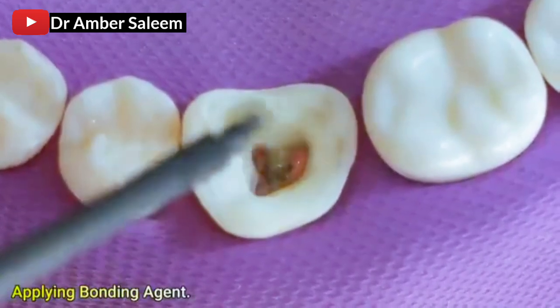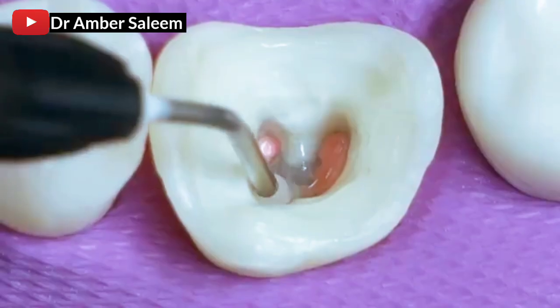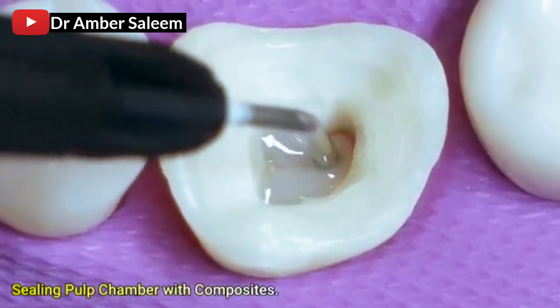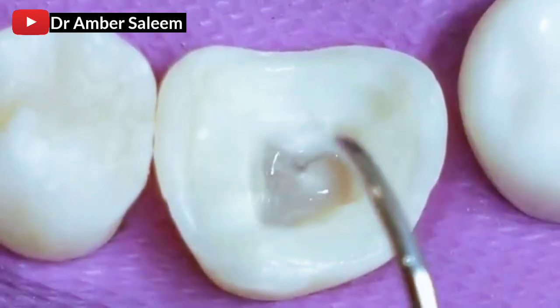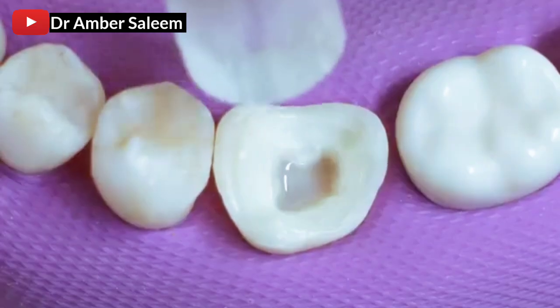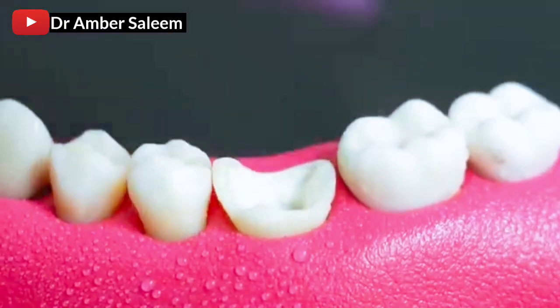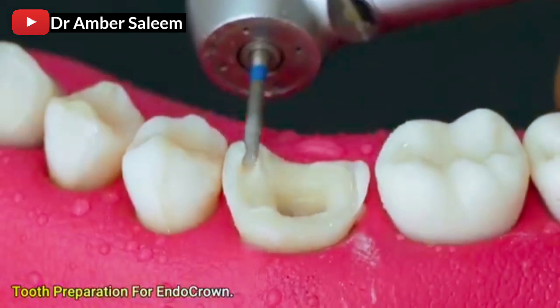Applying bonding agent, sealing pulp chamber with composites, in preparation for endocrown.